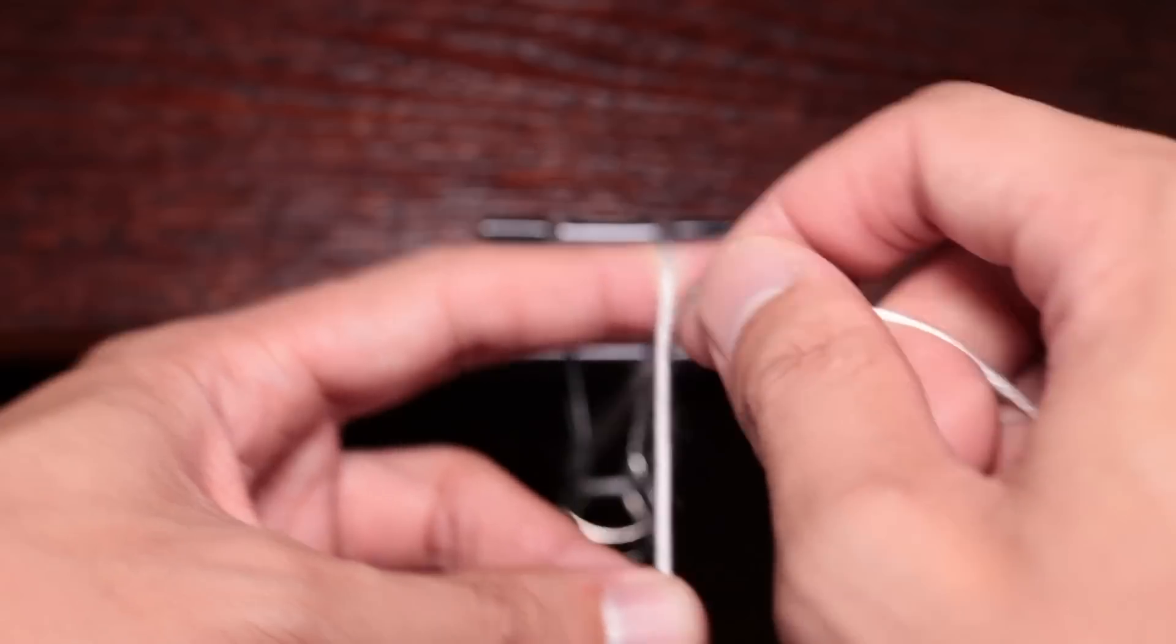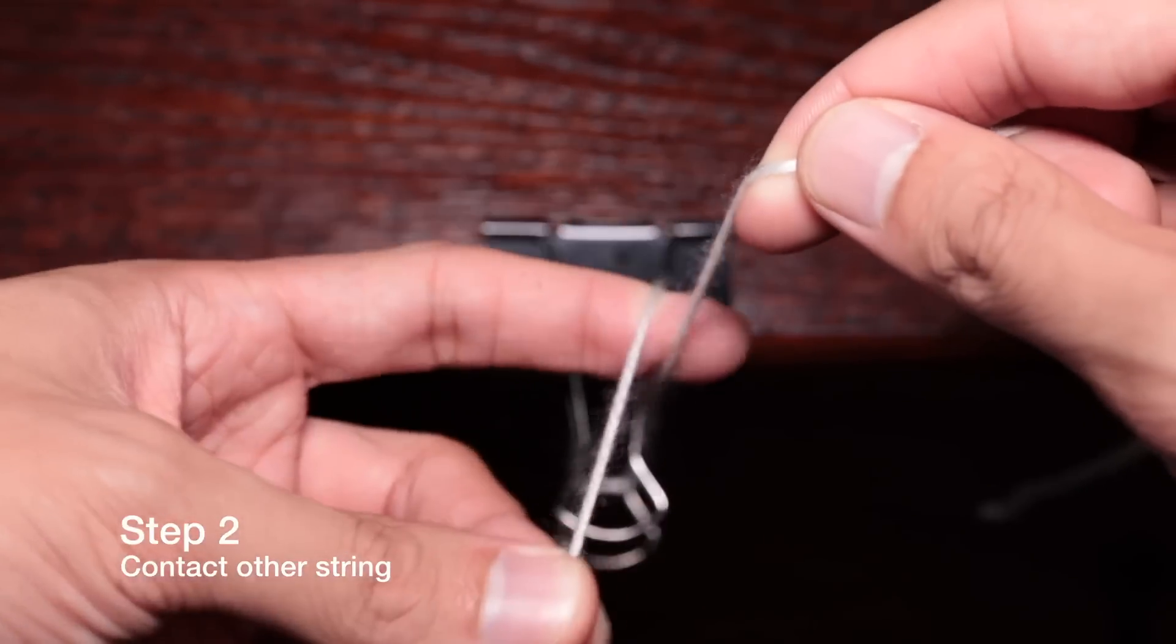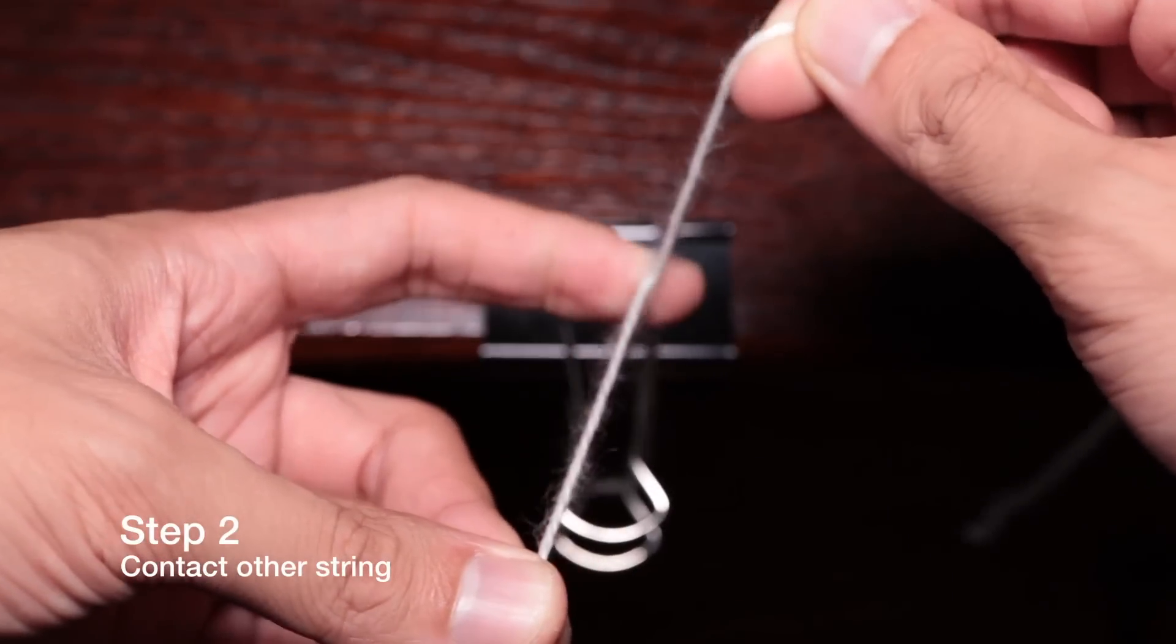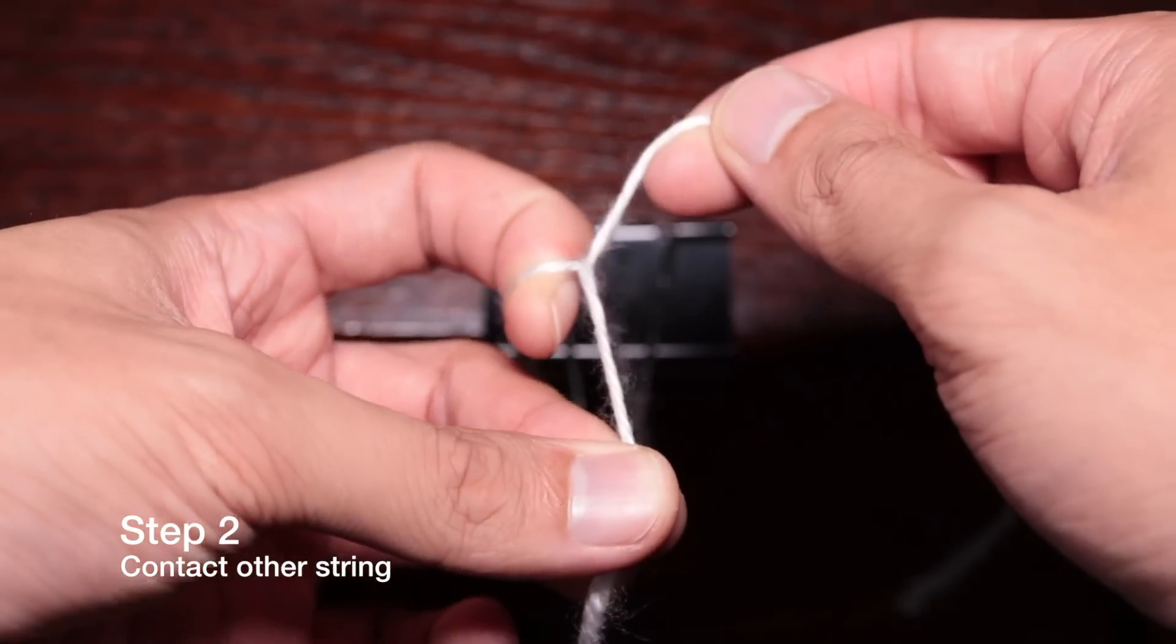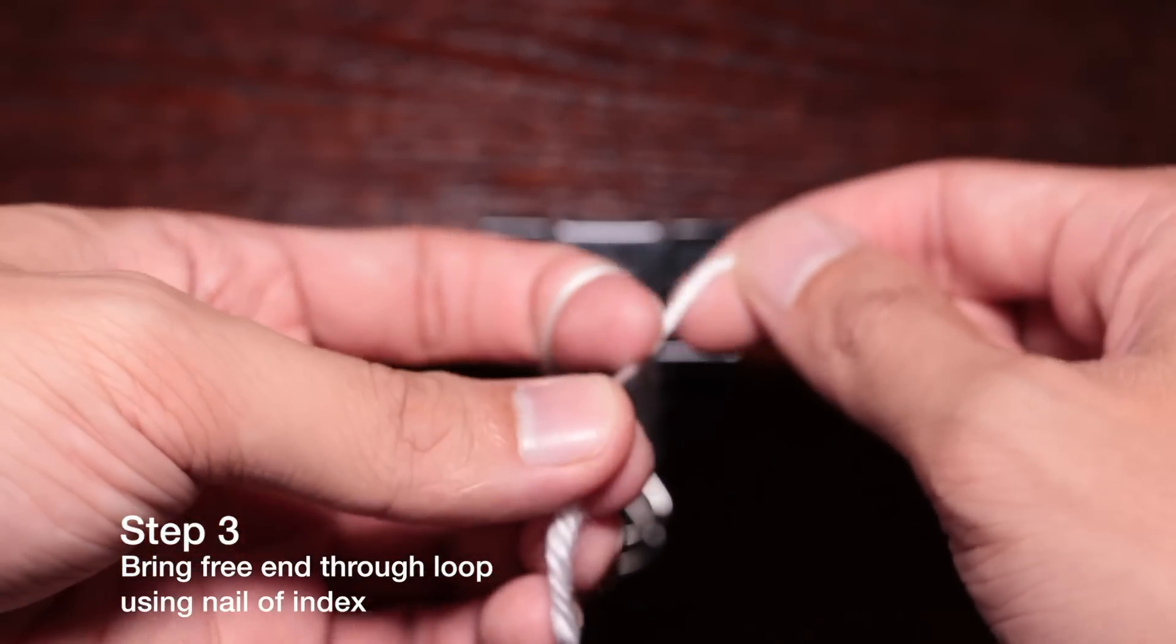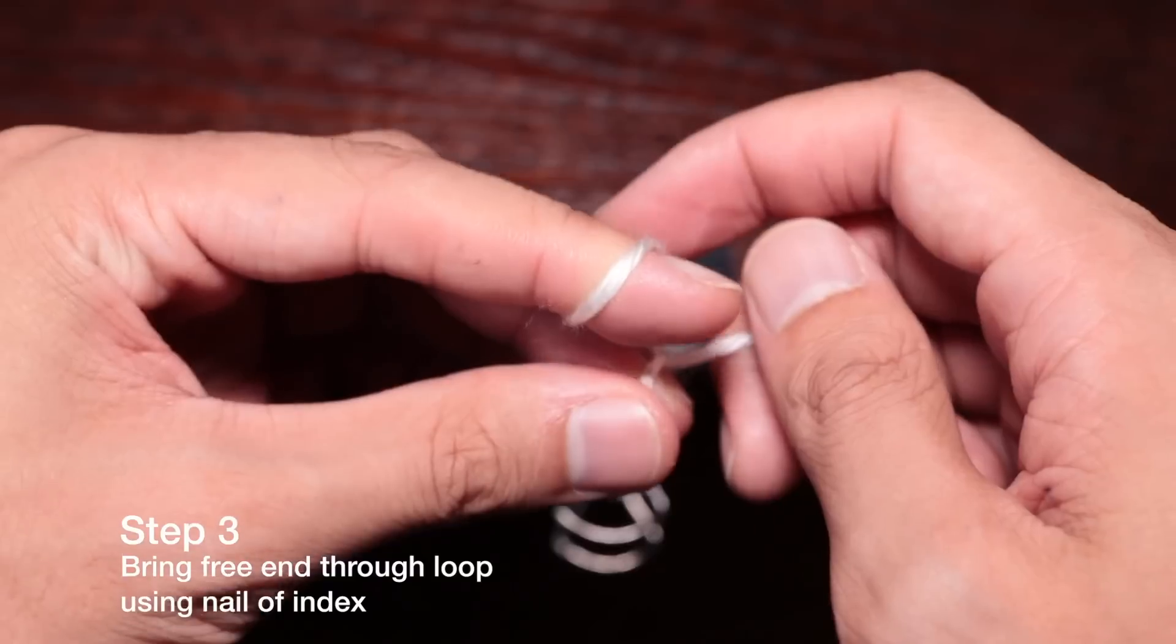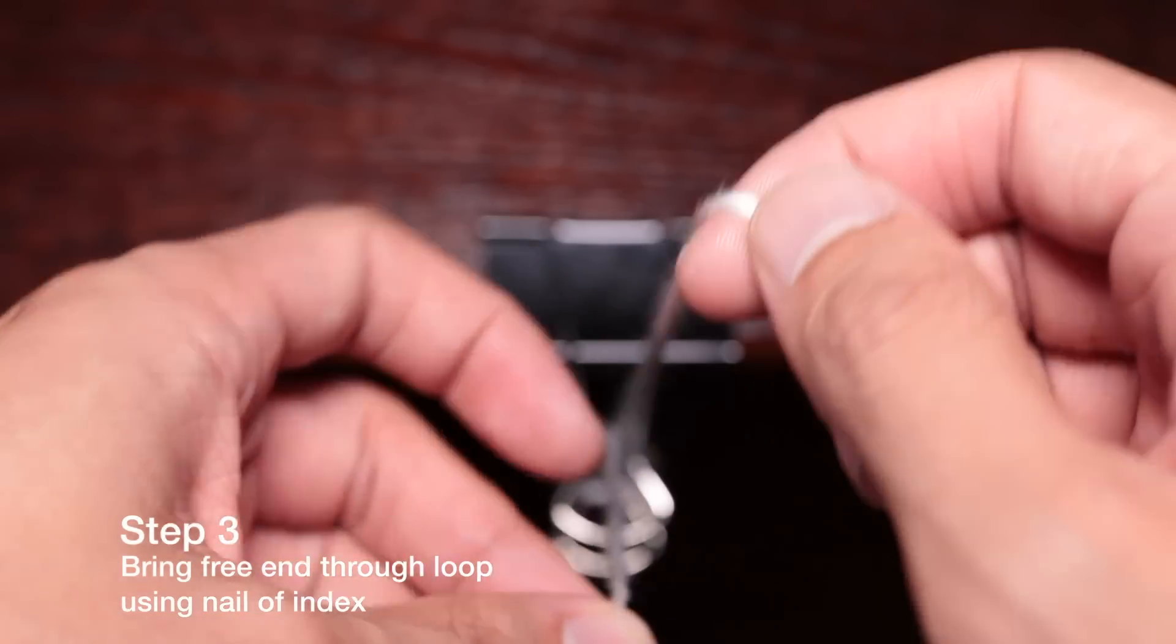Then you're going to be contacting the other string between your index finger and the taut string. Pulling away that string you contacted to then encounter the free end again with the nail of your index finger, you're going to be pulling that free end through with the fingernail. This is quite tricky at first and you're going to have to play a bit with the tensions to see how that works exactly, but it's easier than it seems.